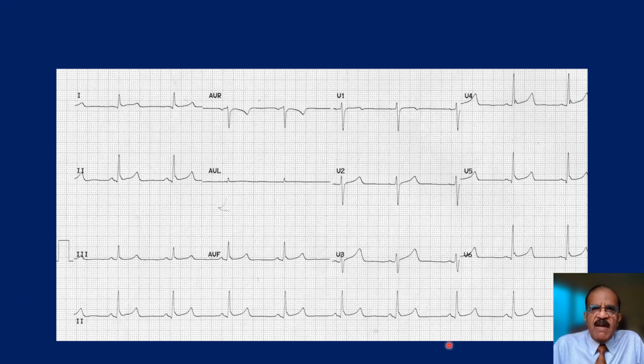We have covered pericarditis, but this is another condition which can cause changes similar to pericarditis. Let's examine. There is ST segment elevation here. There is very noticeable ST segment elevation with concavity upward in limb lead 2. And in precordial leads also you can see ST segment elevation, and you see this J point elevation, and there is a J wave actually.